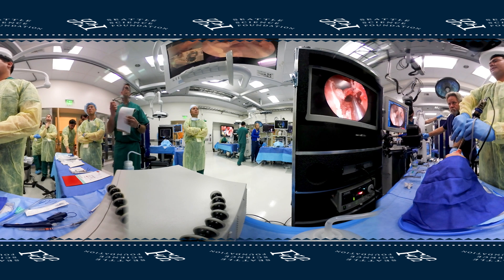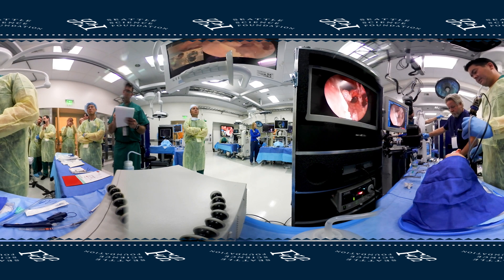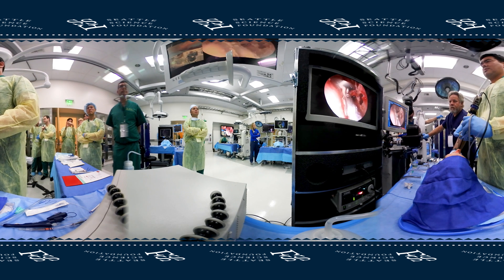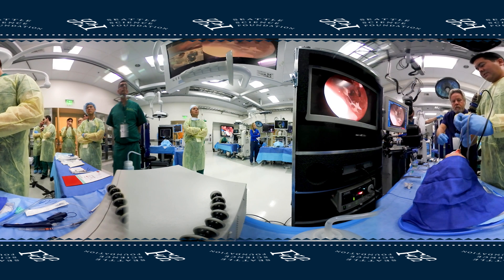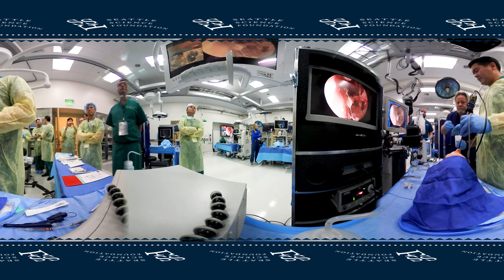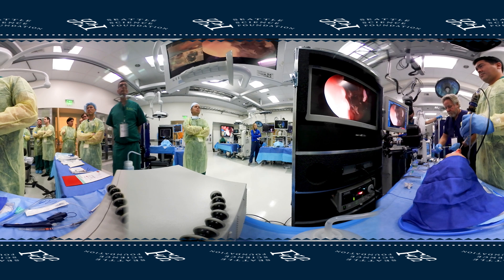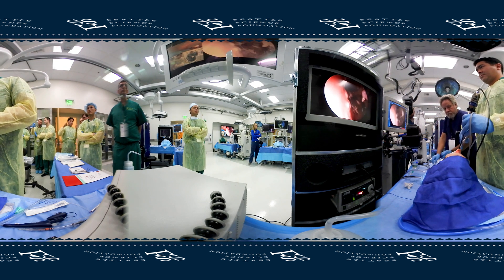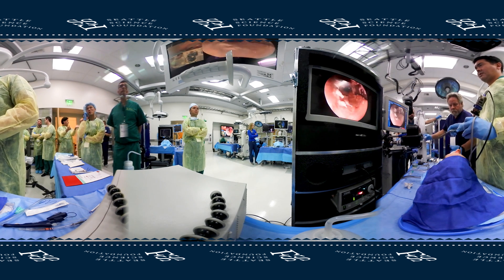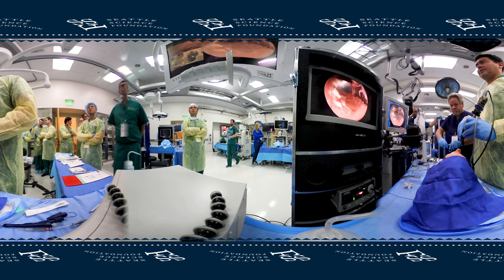You have to realize that the maxillary sinus floor is below the level of the nasal floor, so you're going to have to drill that down. Even before you drill down, you've got access to the anterior border of the maxillary sinus if you use angled scopes.